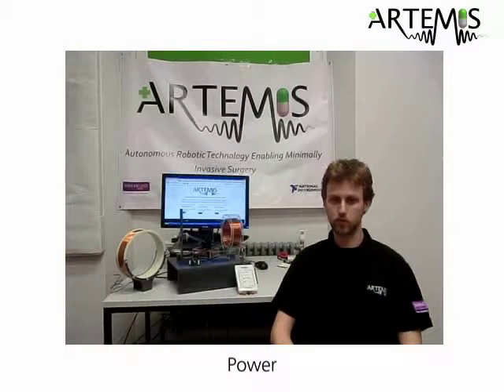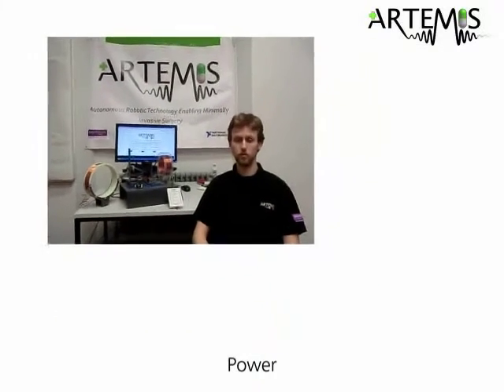To achieve all this, a circuit was designed in order to drive the primary coil with a large alternating current. This would ensure that the magnetic field produced was large enough to transfer sufficient power to the tiny coil that would be inside the body of the patient. The circuit consists of two parts, a sine wave generator and an amplifier. A standard function generator was used to generate the sine wave, and a circuit was designed to amplify this signal and drive the primary coil.